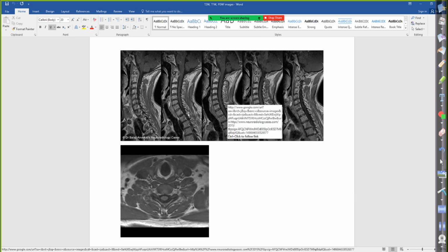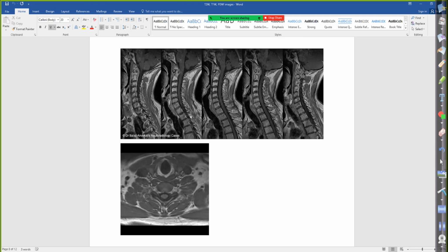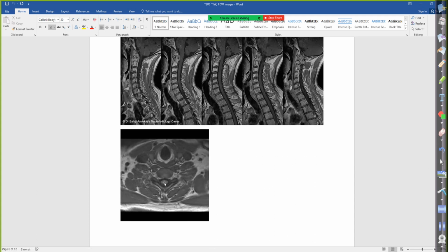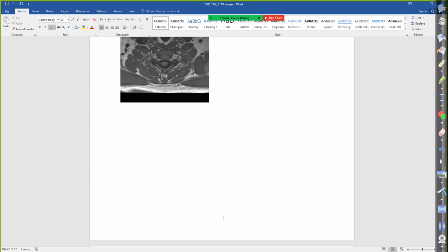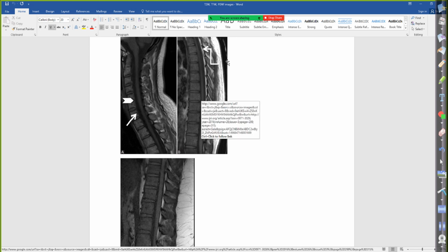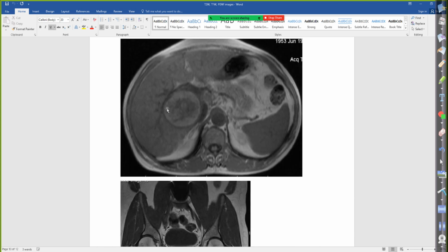Moving on down the spine, kind of the reverse of what we talked about with the T2, let's find those fluid areas around the spinal cord. This is a C-spine because look at how small these vertebral bodies are. C-spine, and you can see the trachea here as well, so you know it's a C-spine. Then you've got your sagittal spines moving on down, but our CSF is dark and our fat is bright, T1. And then here, this is a big abdomen image.